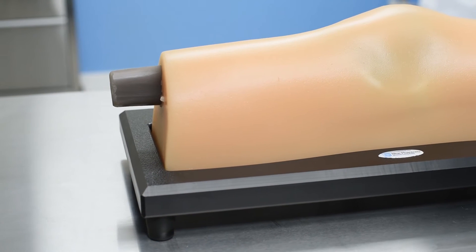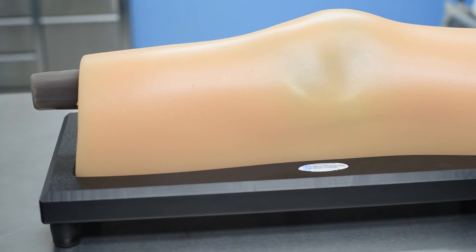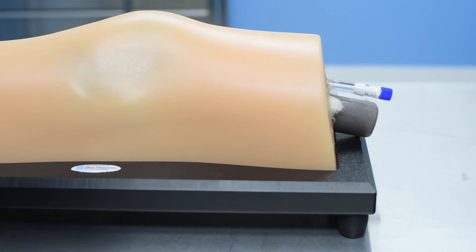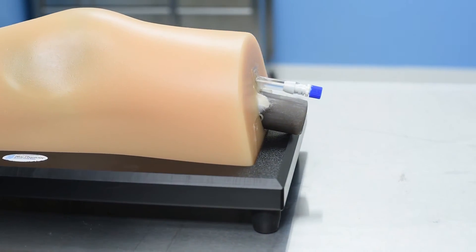Adoption of MSK ultrasound guided knee injection has increased dramatically in recent years. Studies have shown that ultrasound guided knee injections are 60% more effective than blind injections administered into the knee.